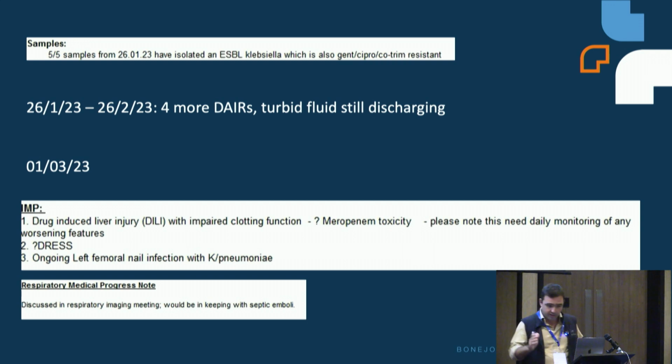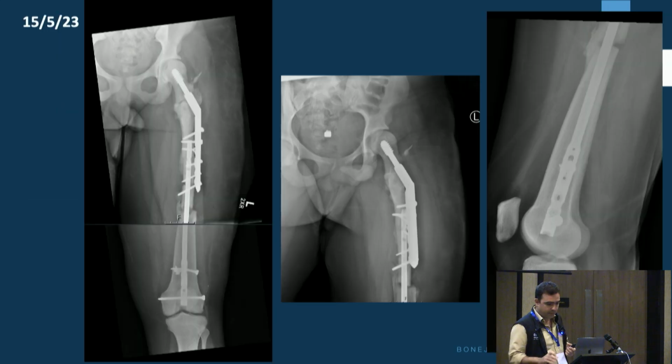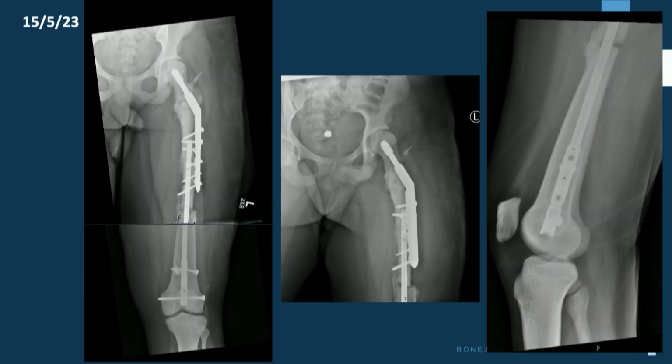A bit of a thriller, and we managed to control everything with some very weird antibiotics. I don't remember the names. This X-ray is from May, 5 months after an operation, with a quiet wound on antibiotics that he cannot stay on for too much longer. So we have to do something at some point.